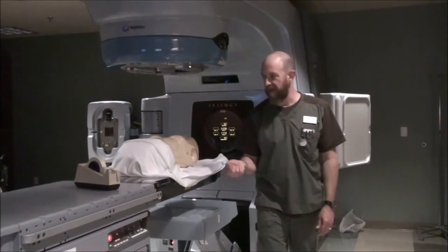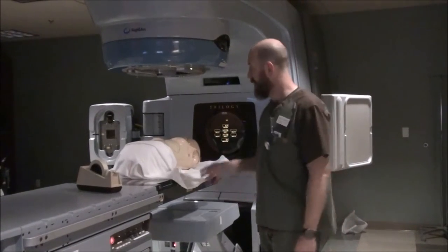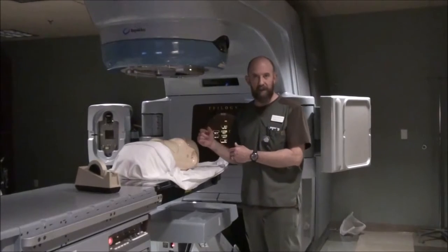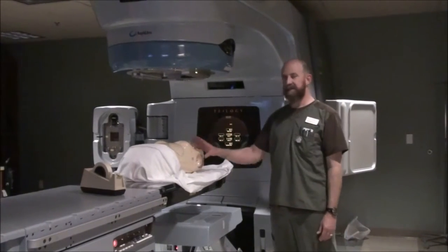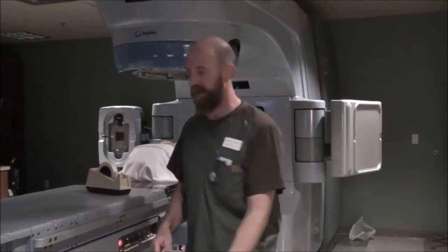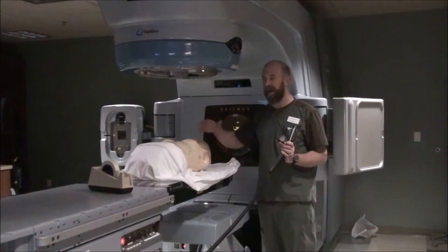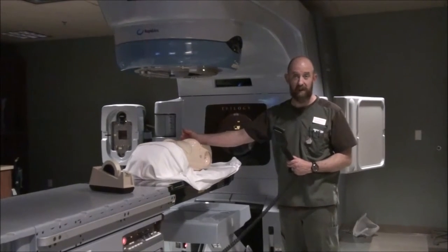All that a dose point does is give you information about the treatment field at particular points other than the CR. For a lung sim, we're going to get the arms up. Have them on a wing board or some other device to get the arms up and out of the way — it locks them in place and makes the setup more reproducible and stable than if their arms were at their sides. Let's assume her arms are up. You're going to center in the middle of the chest for this particular setup. Get the patient straight when you lay them down, get the arms up, and get them in a position where they can comfortably hold it reproducibly.